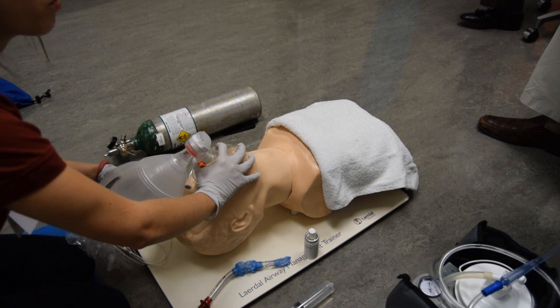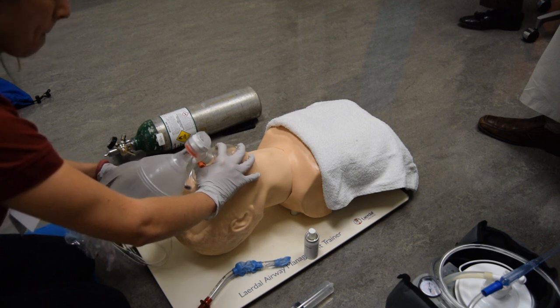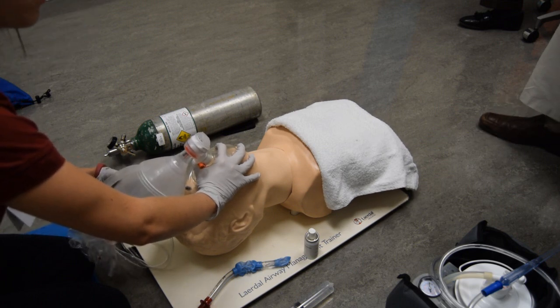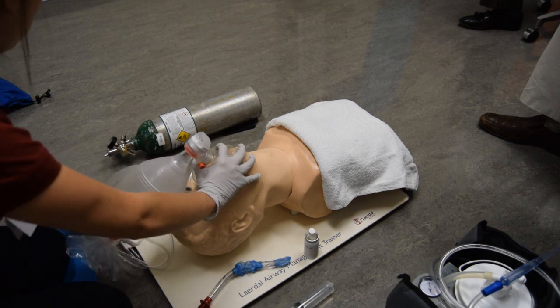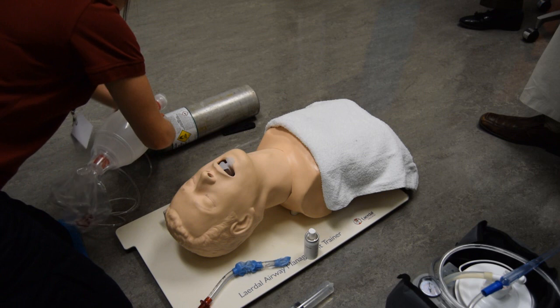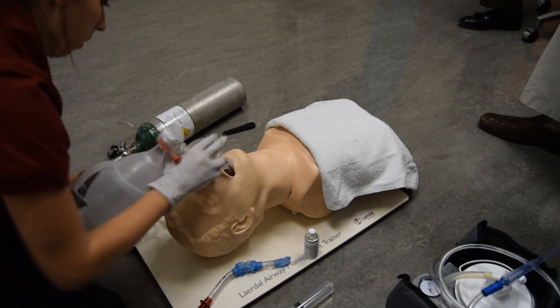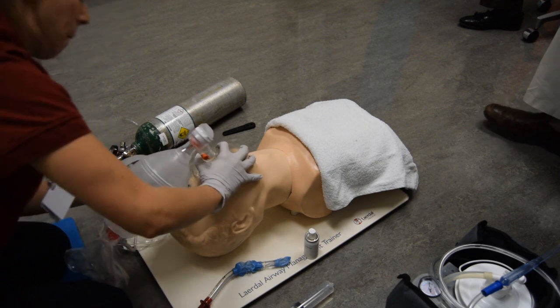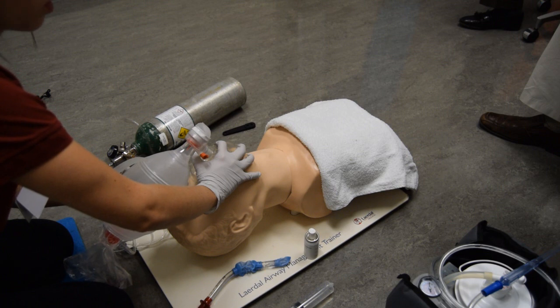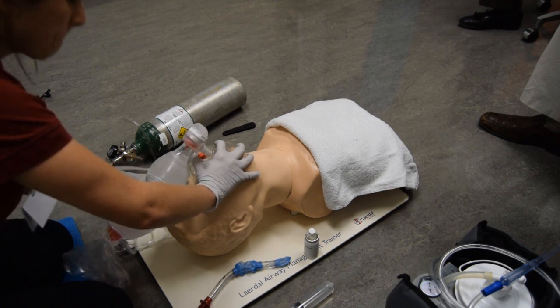Examiner now informs candidate that ventilation is being performed without difficulty and that pulse oximetry indicates the patient's blood oxygen saturation is 85%. Attaches oxygen reservoir to bag valve mask device and connects to high-flow oxygen regulator at 12 to 15 liters per minute. Ventilates patient at a rate of 10 to 12 breaths per minute with appropriate volumes.